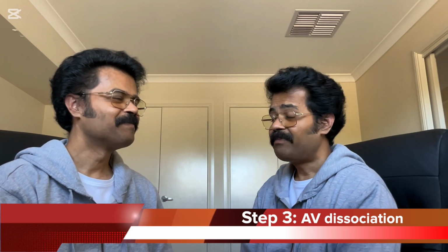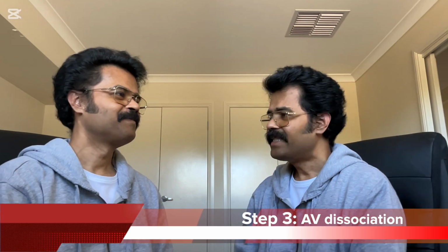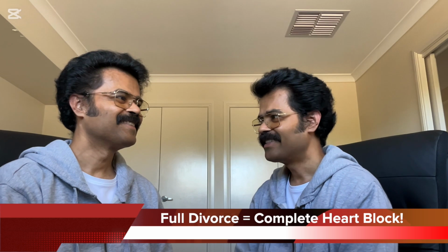So the step 3 is quite interesting. We call this atrioventricular dissociation. So what it essentially means is that there is no communication between the atria and the ventricles. There is no collaboration, no communication. In other words, you can say that there is some divorce between the atria and the ventricles. This is not a complete heart block.